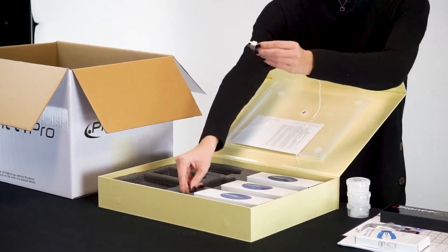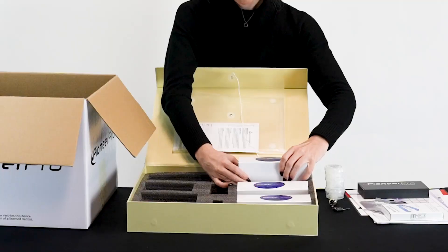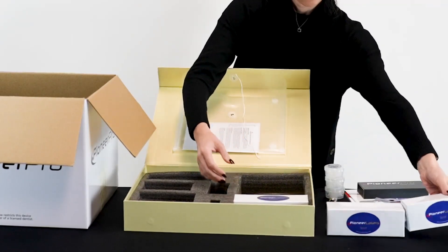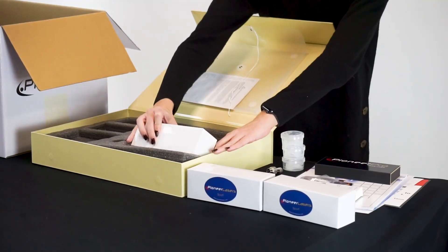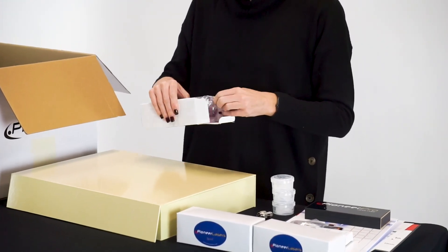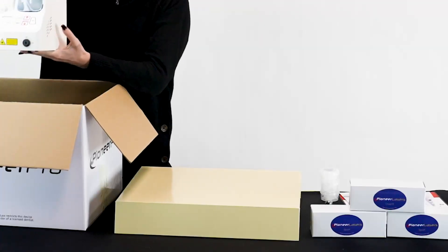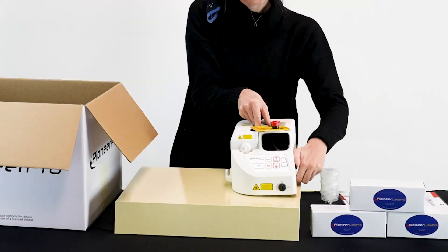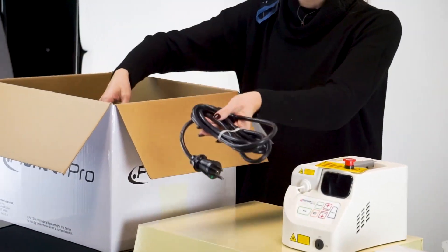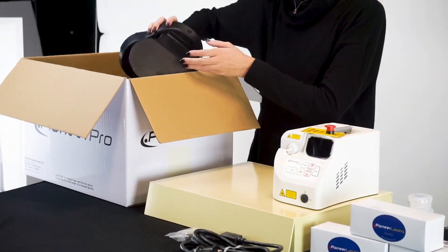One laser key, three pairs of laser safety glasses, one Pioneer Pro diode laser, one power cord, one 9-volt battery, and one foot pedal.